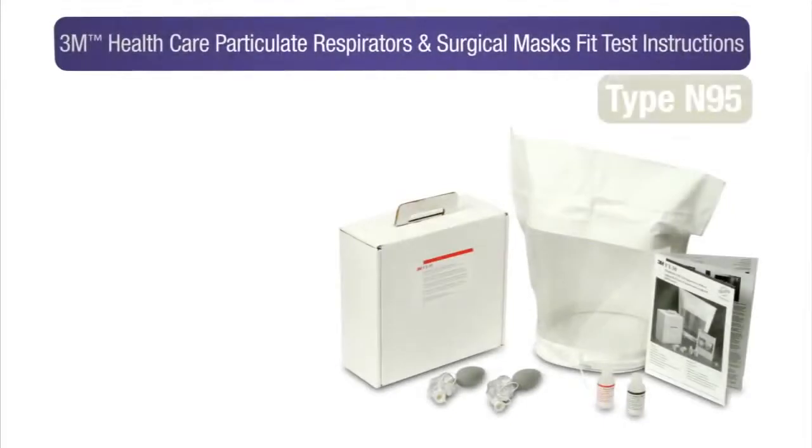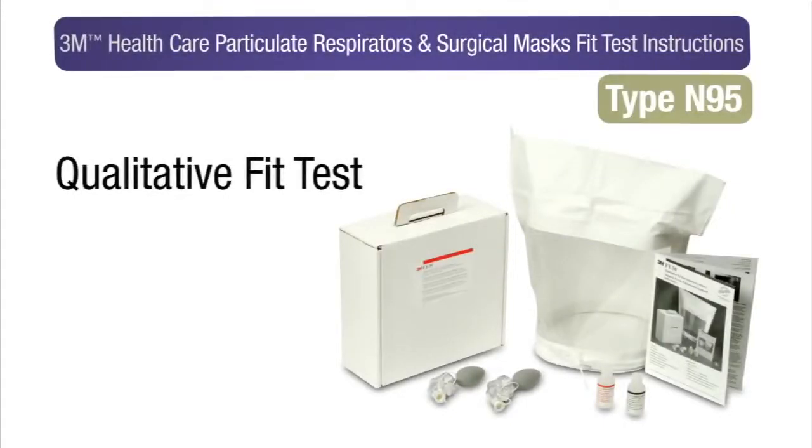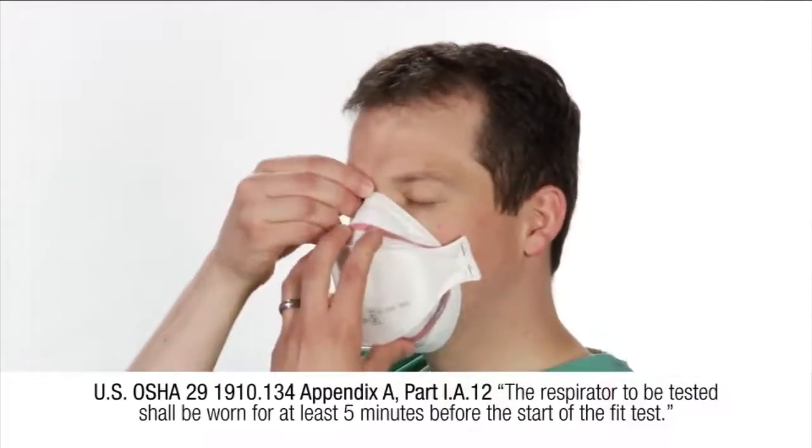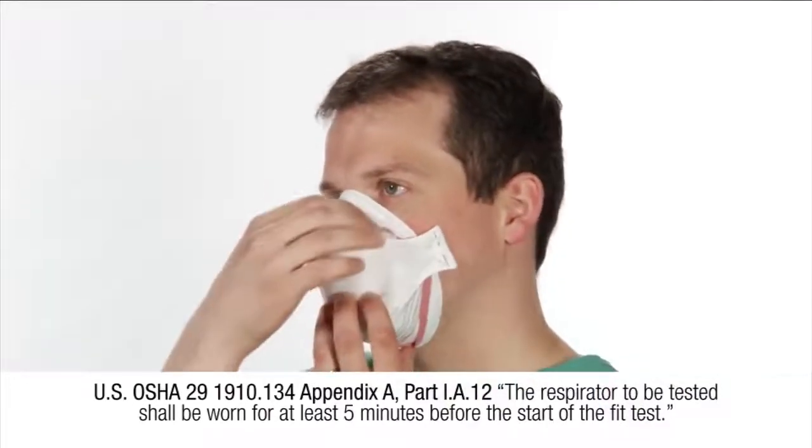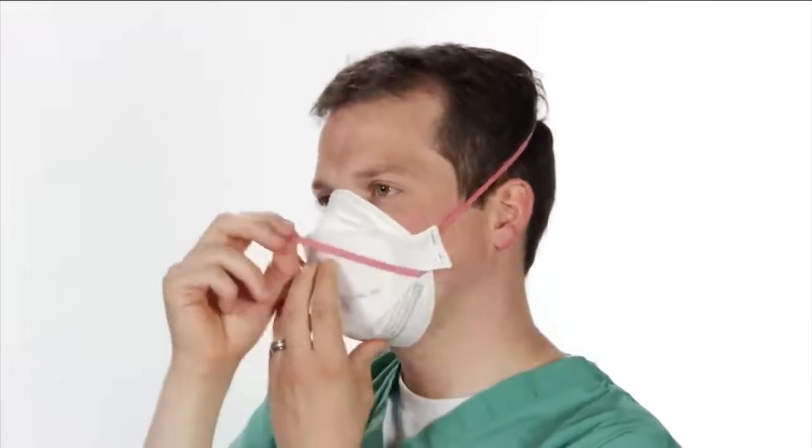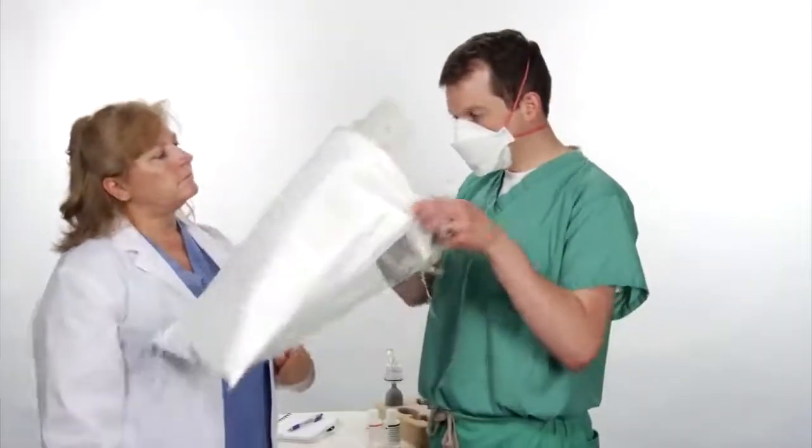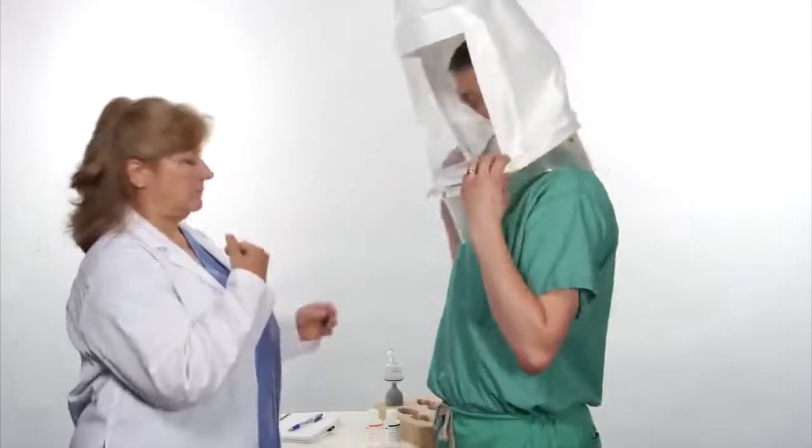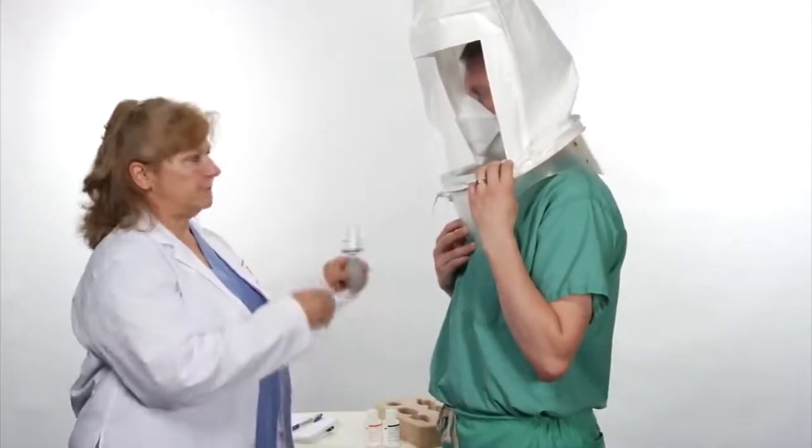You are now ready to conduct the fit test. According to OSHA, the respirator to be tested shall be worn for at least five minutes before the start of the fit test. This allows time for the wearer to ensure they can wear the respirator comfortably. Have the subject don and perform the user seal check as instructed in the fitting procedures for the specific respirator. We are using the 3M 1870 healthcare particulate respirator type N95 for demonstration purposes. Instruct the subject to place and position the test hood as before. Then have them breathe normally through their mouth with their tongue slightly extended.